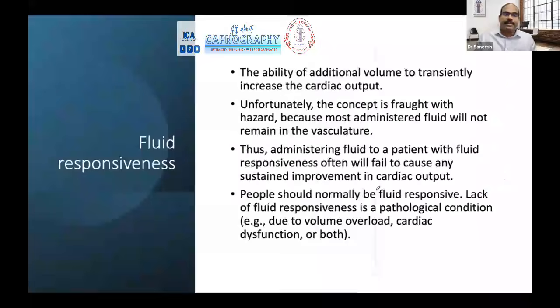Definitely, as I mentioned, in sick lung, the difference between actual arterial PCO2 and end-tidal CO2 increases. Normally it is less than 2 to 5, but in sick lung, the difference increases. So in sick patients, you need intermittent blood gas values to corroborate your EtCO2 trend, which is very important. EtCO2 is one of the monitors which can guide you in your assessment of fluid responsiveness.